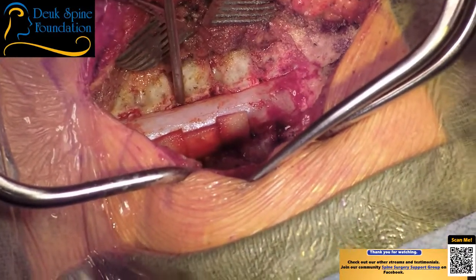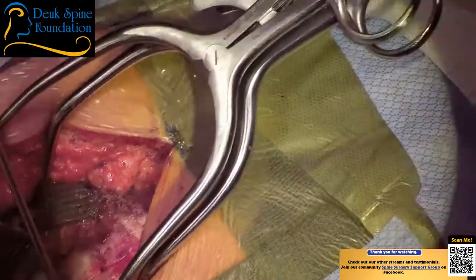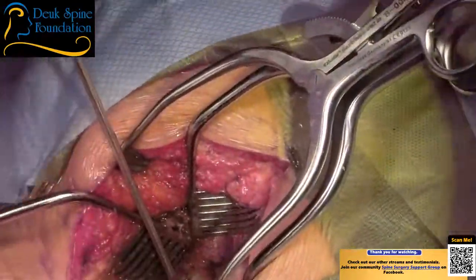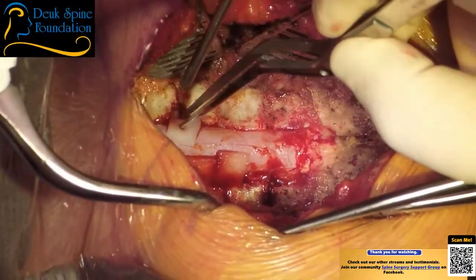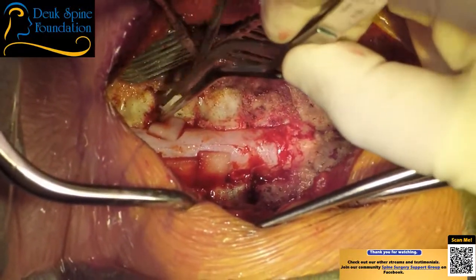So there's the foramen decompressed. Let's have gel foam. A lot of people don't know the right way to do a foraminal decompression. They don't even know where the foramen is, but it's right here. It's very easy. Okay, don't suck on that.